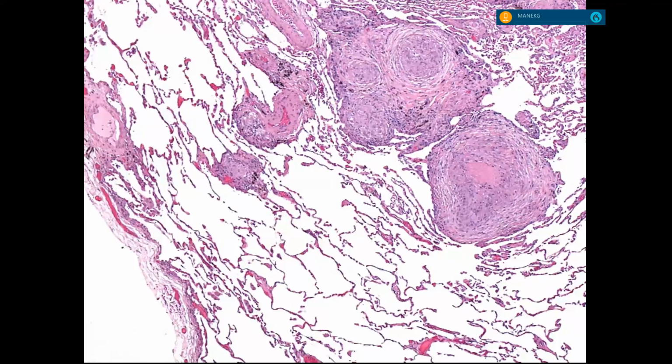So they do have fibroblasts, but there's something else. Granulomas. They are granulomas, which makes them sarcoidosis. Now, this one is a bit odd because I think there's a little necrosis there. So this is not the best picture to show sarcoid. But really, if someone wanted to show sarcoidosis, they would show you a closer picture where you would see those are histiocytes.